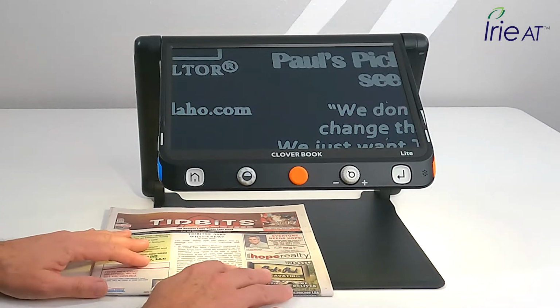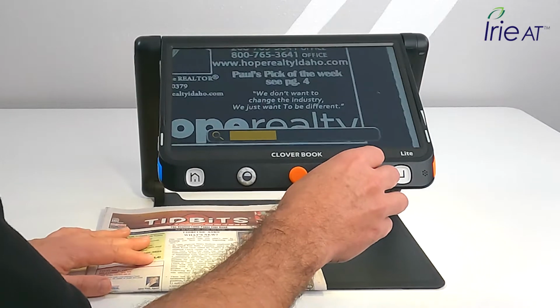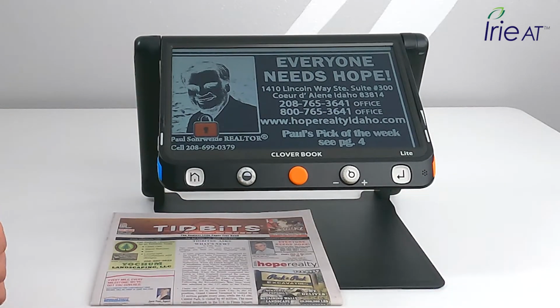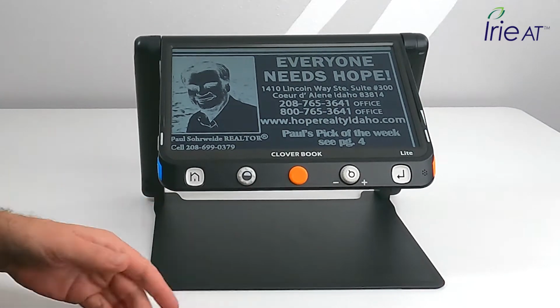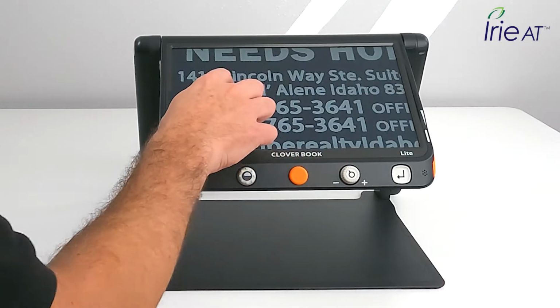So then, let's see, I really want to save this ad for some reason. So I'm going to do that. I'm just going to press the freeze button. Now it's not going to save it, but that's going to freeze it, so I don't have to worry about it. I'm on a recipe or whatever. I've got what I need. I can just move around and see it. So that's kind of nice.